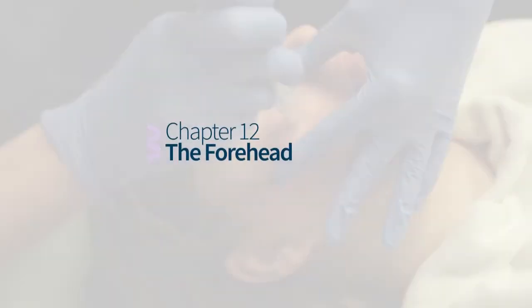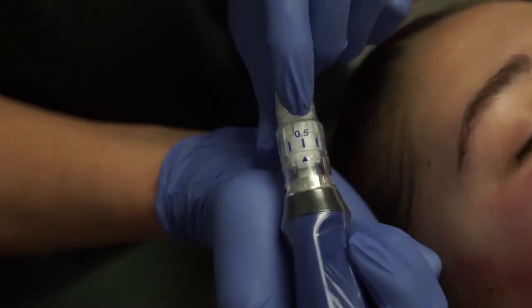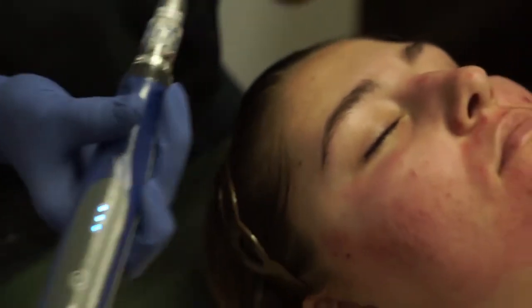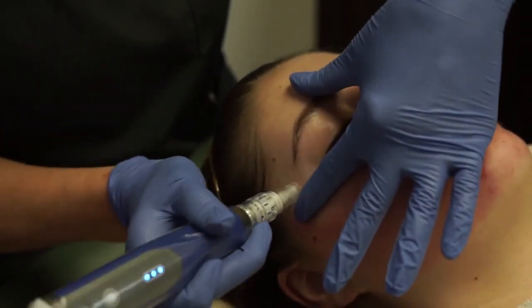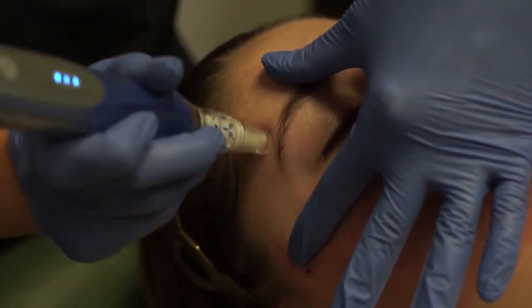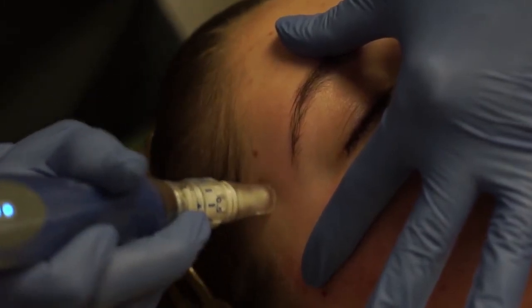The forehead. Recommended depth range for the forehead ranges from 0.25 millimeters to 1 millimeter. In the case of this patient, we are dialing up the depth from 0.25 millimeters to 0.5 millimeters and beginning with our vertical and horizontal passes before moving to small circular motions.